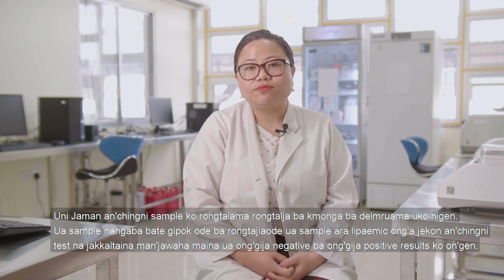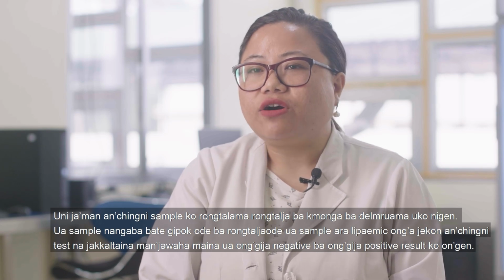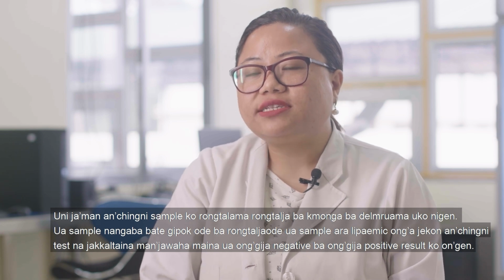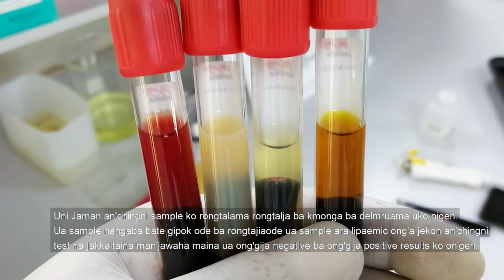The next step, you're going to look if the sample is hemolyzed or not, because for hemolyzed samples, we avoid as much as possible since it gives high false positive results. Next, you're going to look if the sample is turbid or cloudy. If it's too turbid or too cloudy or milky looking, it shows that the sample is lipemic, which cannot be used for such test because it gives false positive or false negative results.